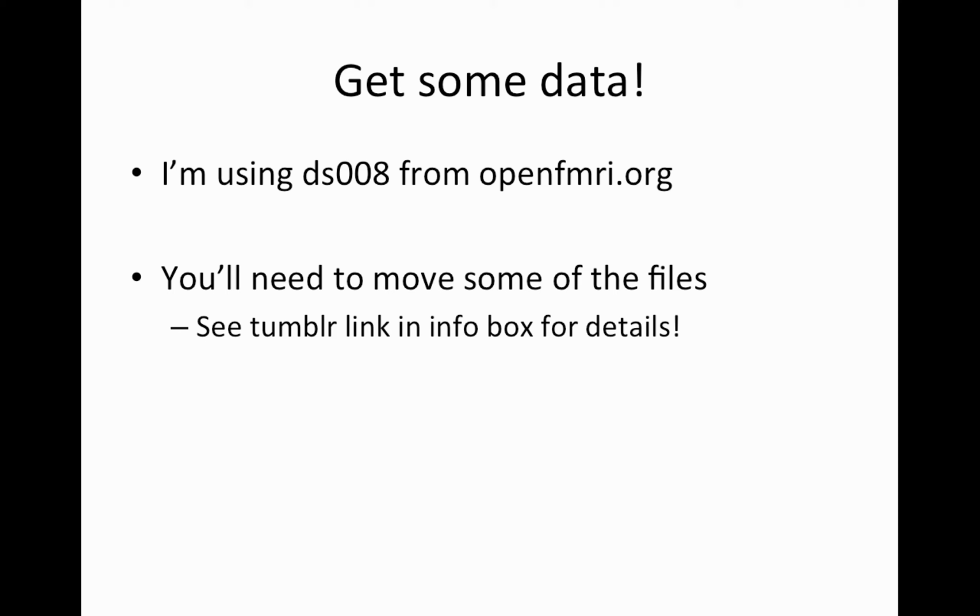So I'm using the DS008 data. Again, go to the Tumblr post. I have a whole section on where to get these data, and also I have a Python script linked into that Tumblr post about moving some of the files.